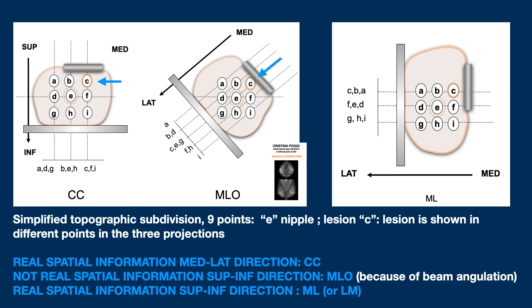To get real upper-lower direction information, I have to resort to the lateral projection. Even if, again, we have the superimposition of the medial side on the lateral one — it is a mediolateral projection — the same lesion that was seen central in the MLO is actually in the upper quadrant.